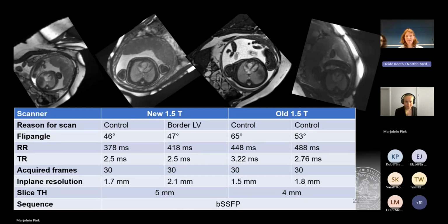That's interesting. I think my colleague Domenico is going to talk about that as well. Yeah. What do you have? This is really interesting because this key parameter of the angle can really change the border and the contour of the myocardium. And then I will show also something about that. So really curious.